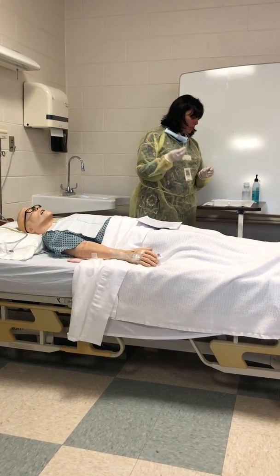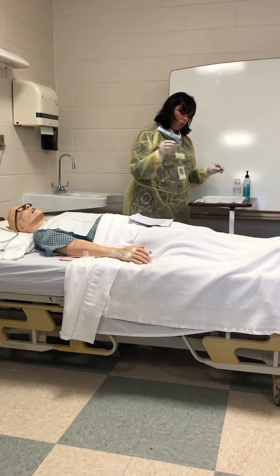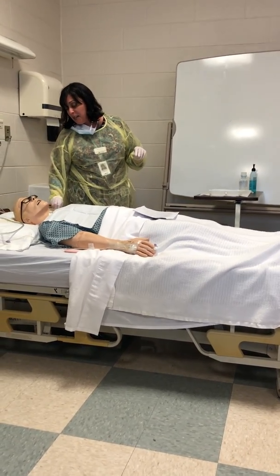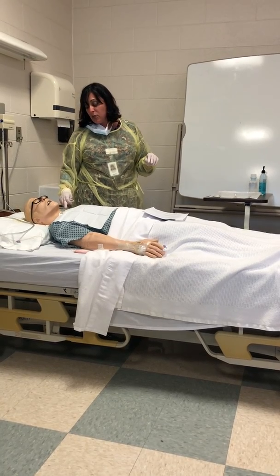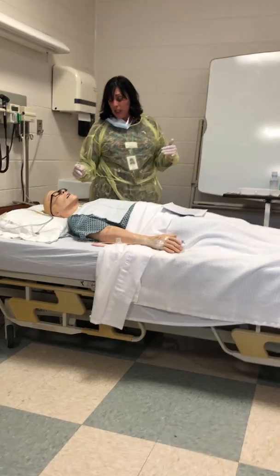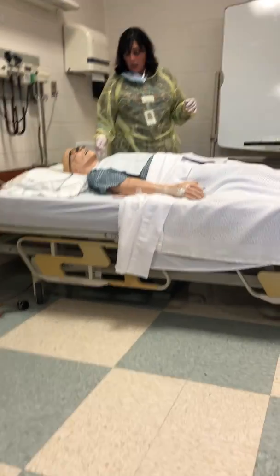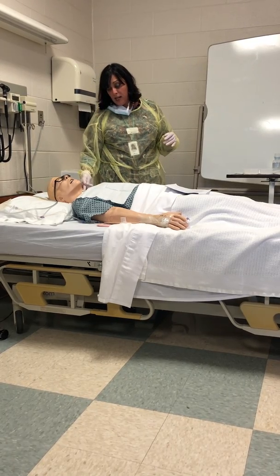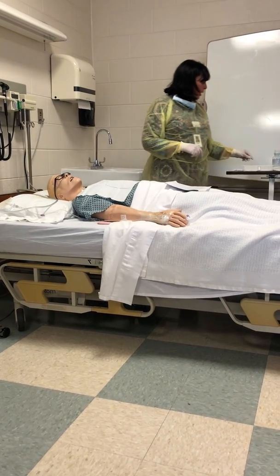I got these little things too. They're used for whatever. Put that in there and just wipe away any bubbles. Make sure that it's all clean around the stoma. You wanna look at the stoma, make sure that it's not excoriated or bleeding, that everything's intact. So you have to look underneath of the faceplate. You can tilt the faceplate to look at it and make sure everything looks good and healthy.